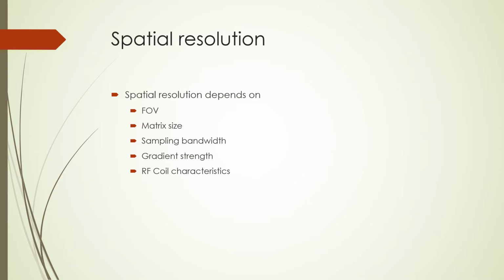In general, MRI can provide spatial resolution approximately equivalent to that of CT, with pixel dimensions on the order of 0.5 millimeters to 1 millimeter for a high contrast object and a reasonably large field of view greater than 25 centimeters. Slice thickness in MRI is usually 5 to 10 millimeters.